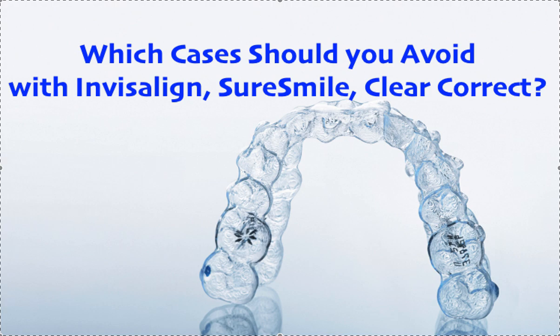So those are the kind of 4 buckets I'm gonna give you right now of what not to take for Invisalign. And remember, it's gotta be comprehensive. No general dentist should be doing anything in light or express, ever. Unless you've done thousands and thousands and thousands of cases. I promise you it'll cost you more, it'll give you more headaches. Everything goes in comprehensive, okay?